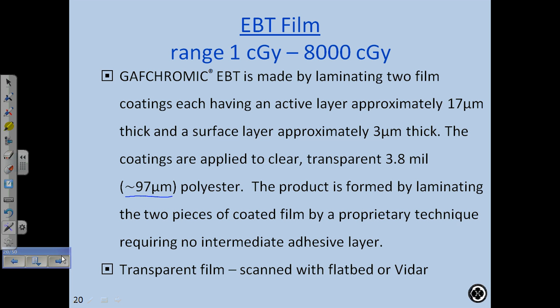So we can scan this now with the same kind of scanner we're using for the radiographic film, like the VIDAR scanner. Have you folks seen a VIDAR scanner? We have one. We have one in our treatment planning lab. It's a scanner where you drop the film in, and I'll show you pictures of it. And you shine light through it, and on the other side, there are light detectors.